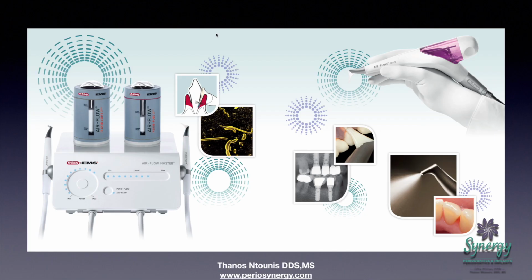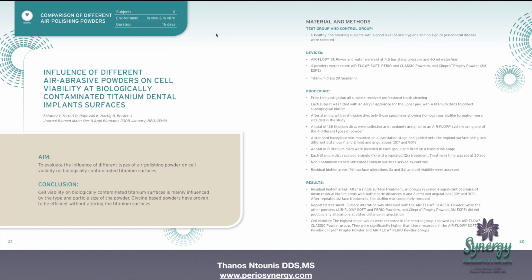Before that, of course, I like to clean the area. In my practice, we have recently introduced the EMS system, the Airflow. It uses, around implants, glycine powder of 25 micrometers, and there is a considerable body of literature out there that shows that with the use of the proper powder, we're not introducing any surface alterations on the implants.